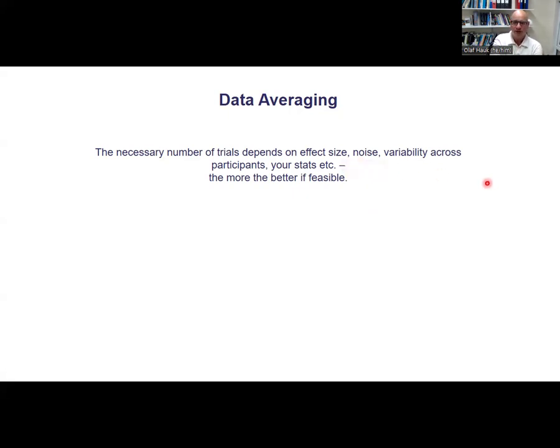If you have a huge effect, then you might just need a few tens of trials. If you have a tiny, subtle effect, then you might need hundreds, or maybe you will not get any effect at all. So it's really not clear. A statistical power analysis is a good idea if you have data to do that properly. Otherwise, I guess you'll have to learn the hard way.